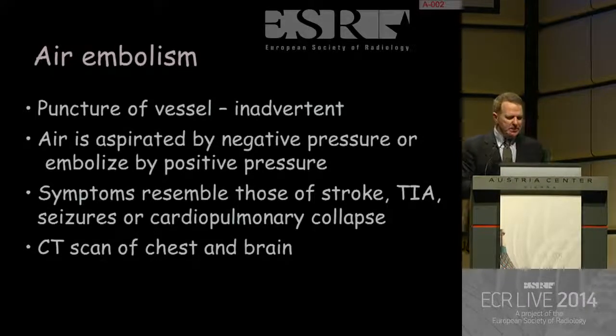The symptoms resemble those of stroke, TIA, seizure, cardiopulmonary collapse. Anytime that you have a patient who was feeling well before the procedure, and all of a sudden becomes strange, unconscious, rolls over his eyes, you have to think about air embolism. At that point, you redo a CT of the chest and the brain.